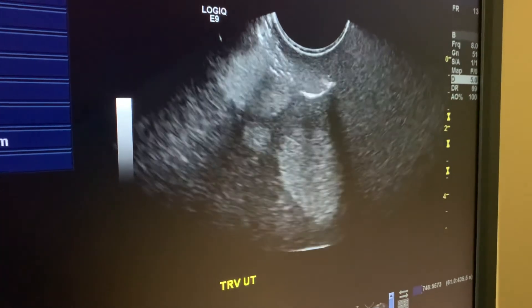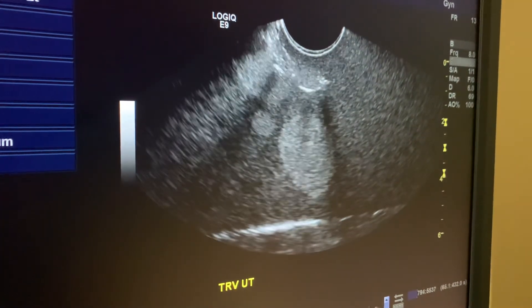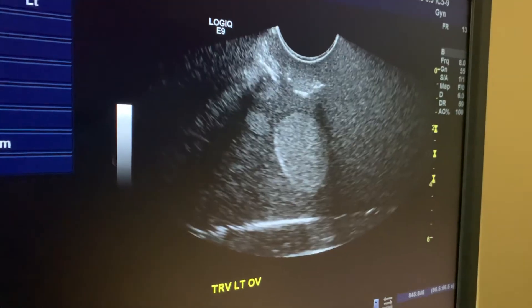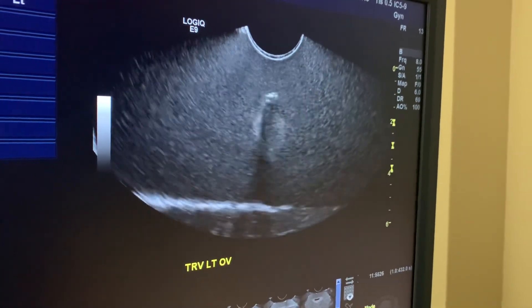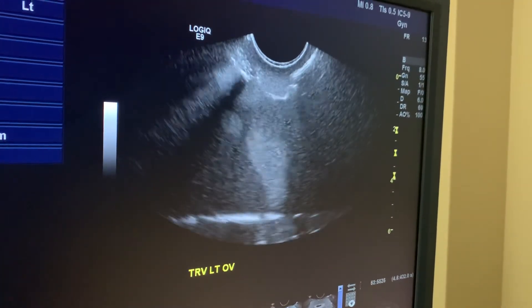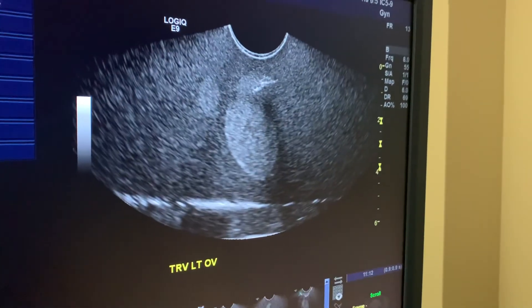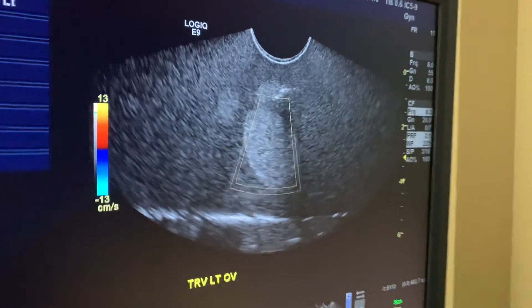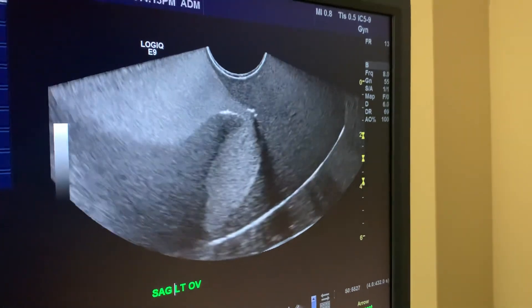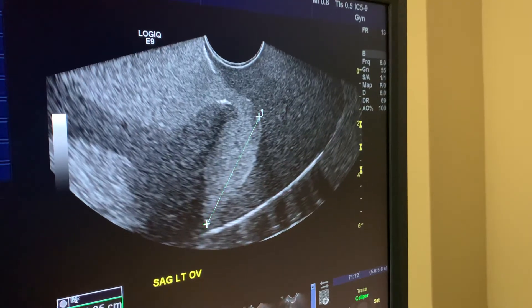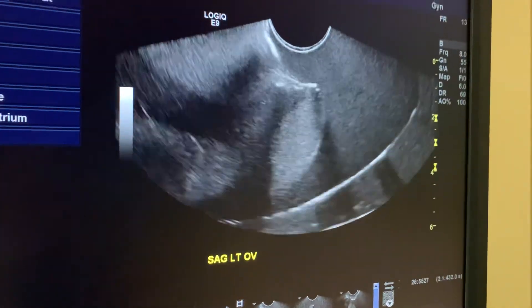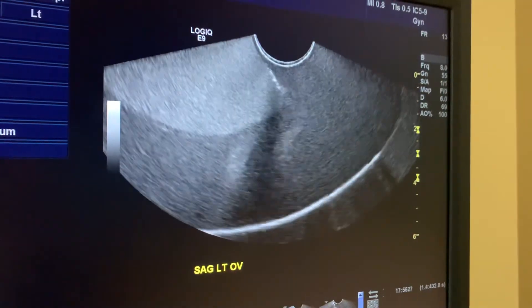With the probe in transverse, when I turn to sagittal over the ovary it cuts through it and the ovary appears in transverse orientation on screen. Document your organs based on organ orientation, not probe orientation — so even though the probe is in sagittal, this is labeled 'transverse left ovary.' Sweep through the entire ovary to see all of it. Measure at the widest plane in transverse, then apply color Doppler.